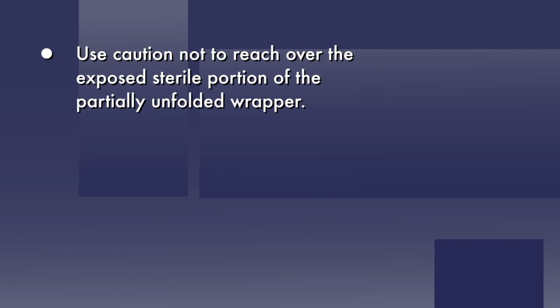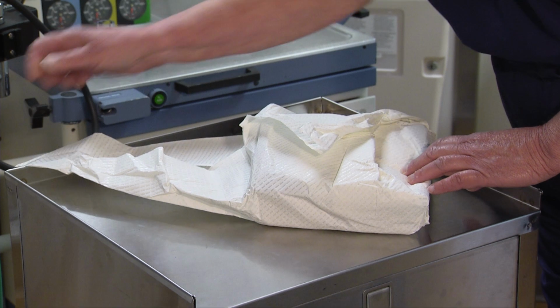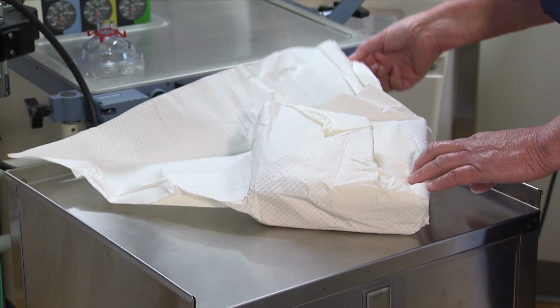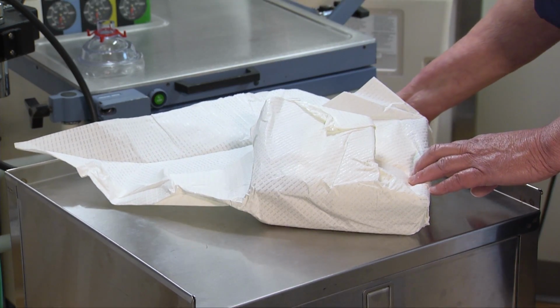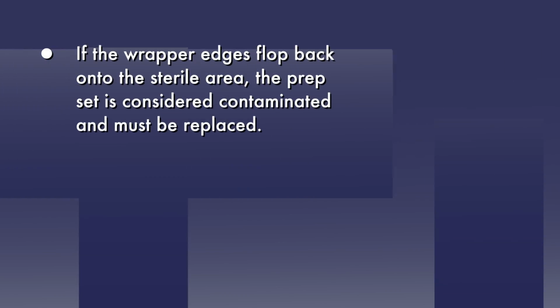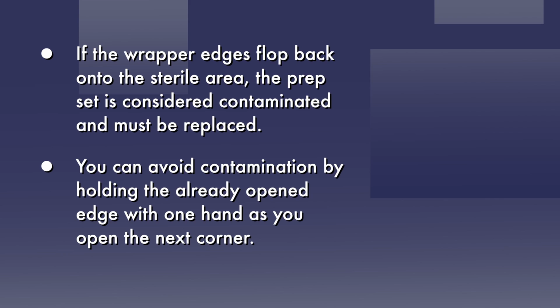Use caution not to reach over the exposed sterile portion of the partially unfolded wrapper. Grasp the tab of the second corner and open it laterally. Extend the wrapper edges to the side so that the wrapper lies flat. If the wrapper edges flop back onto the sterile area, the prep set is considered contaminated and must be replaced. You can avoid contamination by holding the already opened edge with one hand as you open the next corner.